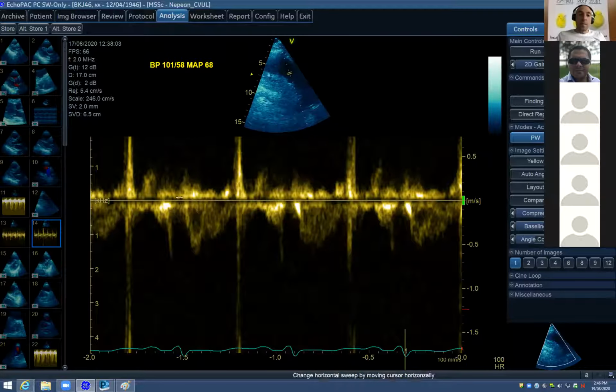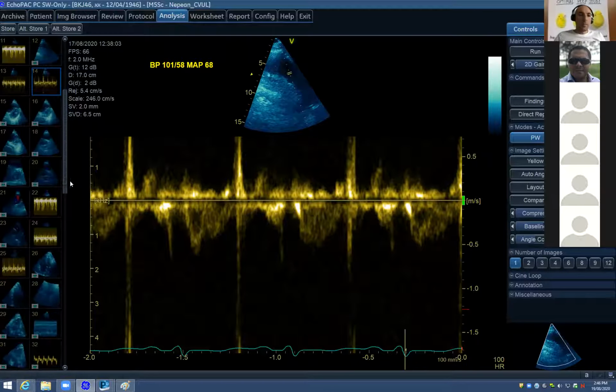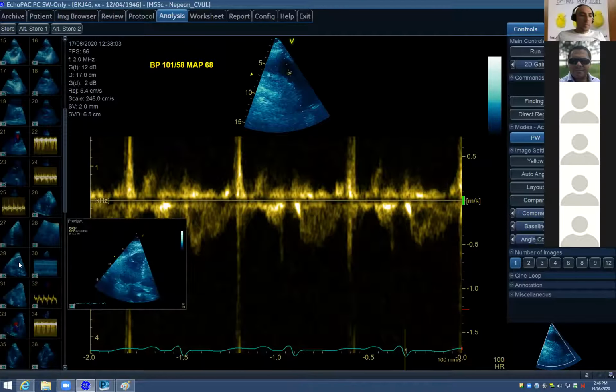So just to summarize what you said, even though it looks like we've got the same systolic pulmonary artery pressure, we don't, because the RV is clearly not working very well. We've now got this marked systolic notching, which goes along with the idea that we've got markedly elevated systolic pulmonary pressures. That's beautiful. What do you think about the RV function?